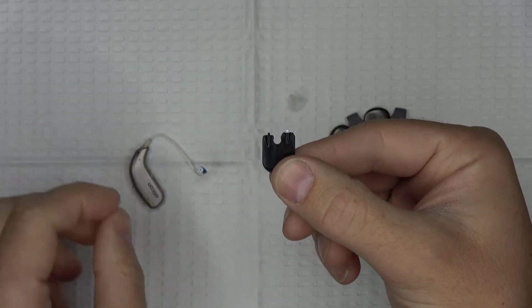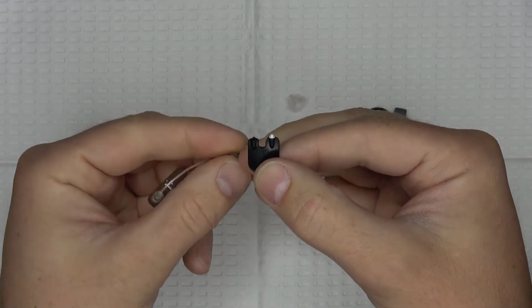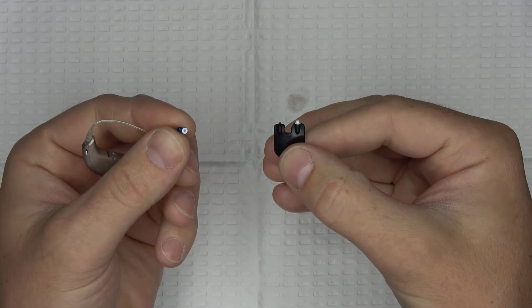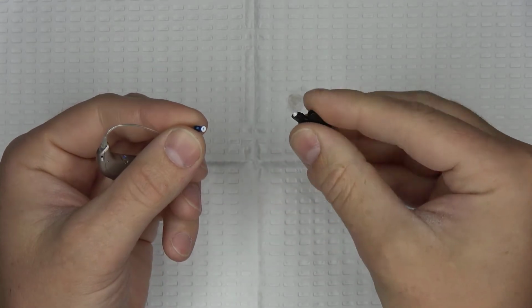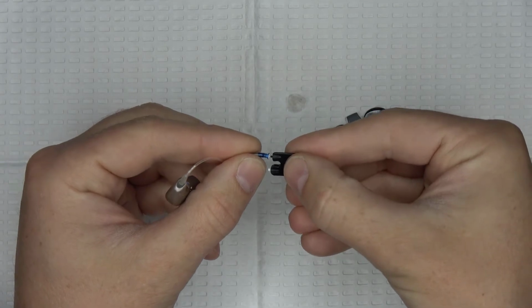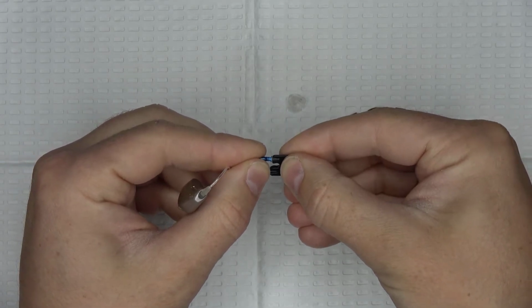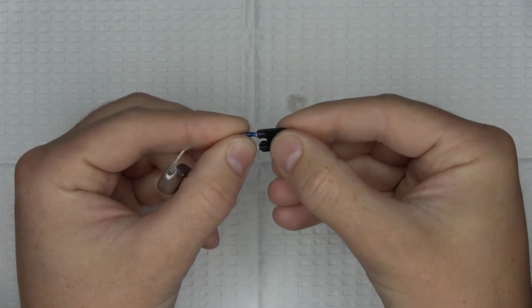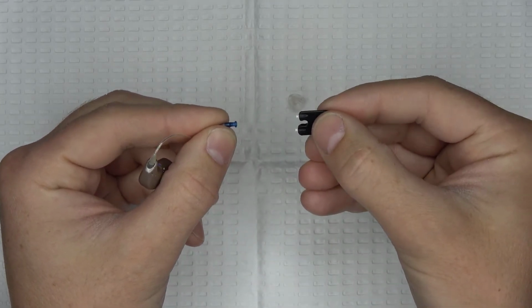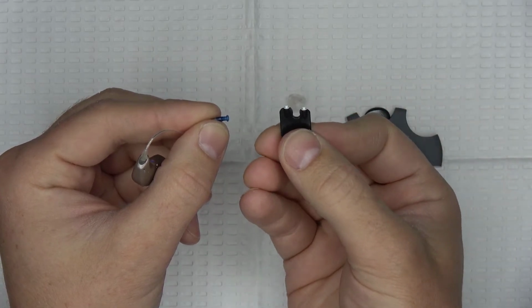Next, we want to remove the existing wax guard from the receiver. To do this, take the receiver in one hand and pinch it between your finger and thumb. In the other hand, take the wax guard pick and insert the empty tip of the U into the opening of the old wax guard in the receiver by gently pushing it in. The empty tip of the U will catch the old wax guard and remove it from the receiver once you pull the pick away from the receiver.